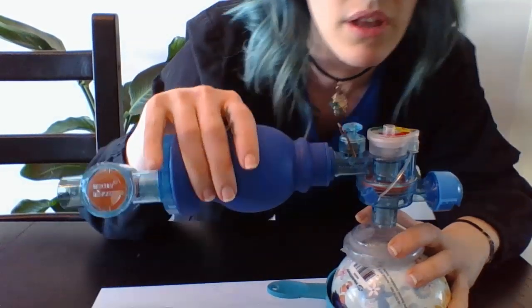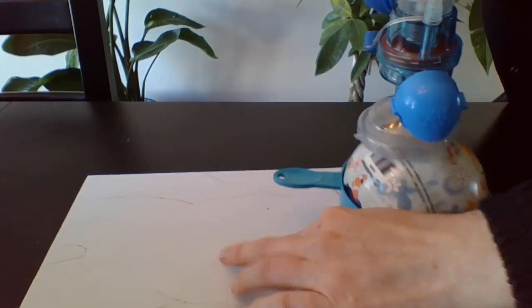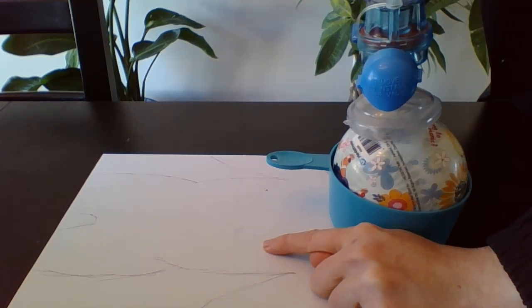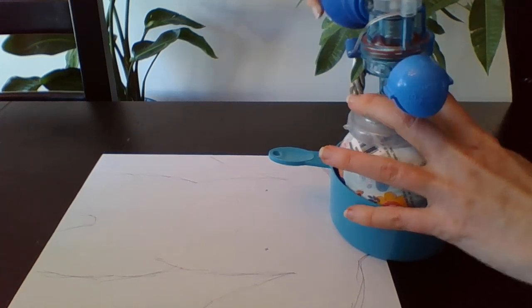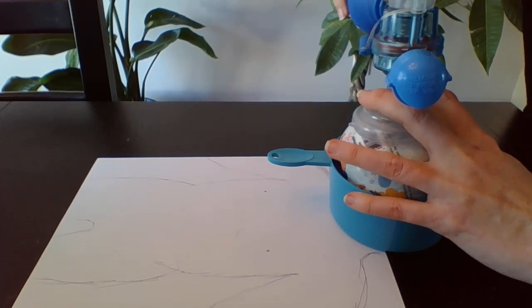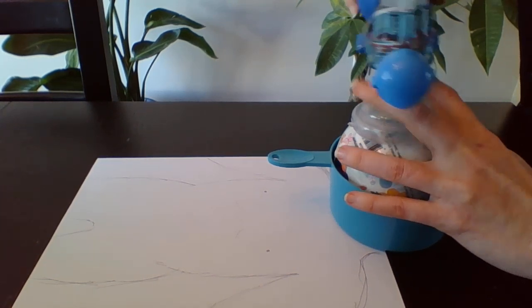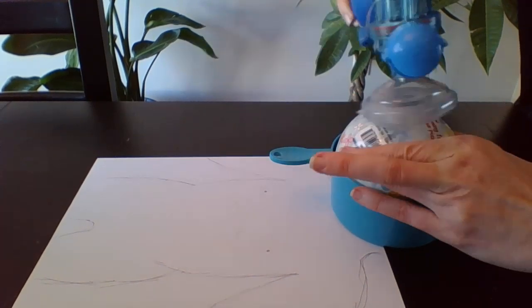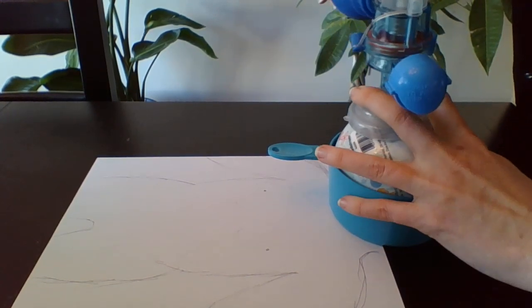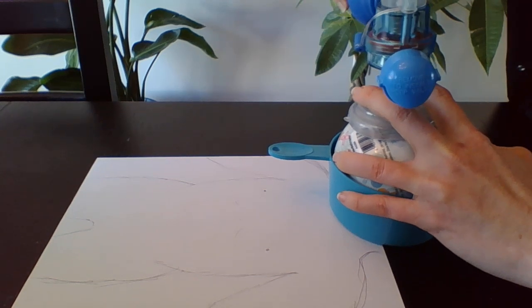Now, ideally, you're going to be off to the side with your bag so that you can see the baby's chest, because what you want to watch for is chest wall movement so that you can assure that the air is getting into the baby properly. So you're going to hold a nice firm grasp to hold the baby's head in position. You might also have a second person helping to keep the baby in position. This is often pretty tricky. Also, we would have wiped the face a bit so that it's not slippery and wet, because that makes it harder to get a proper seal. So you're going to hold it steady, and use your fingers to keep the baby's head and chin in the right position.